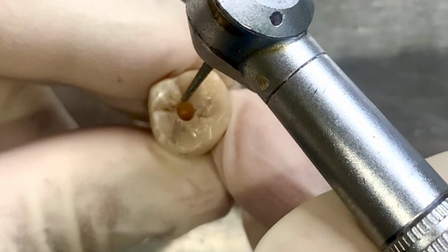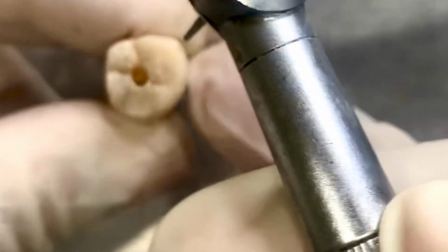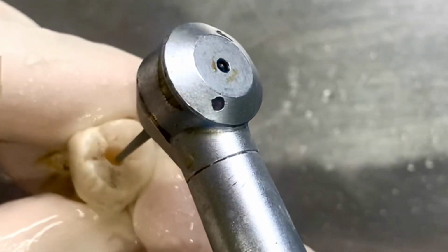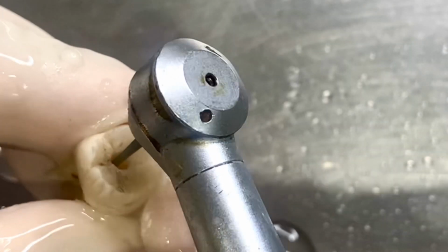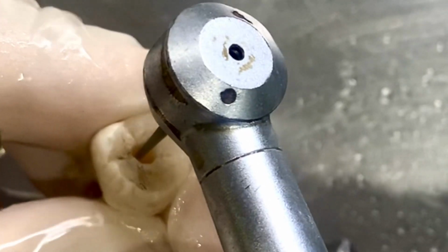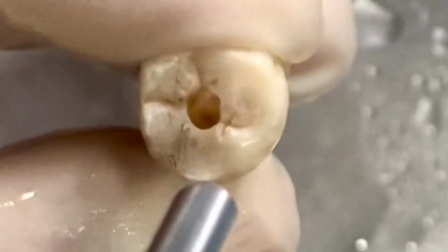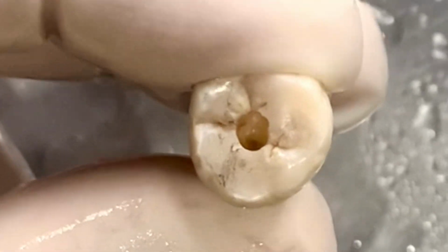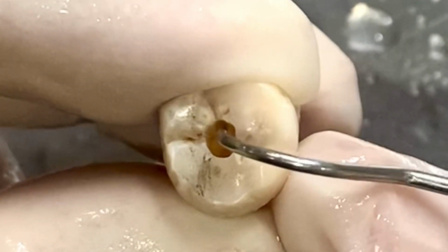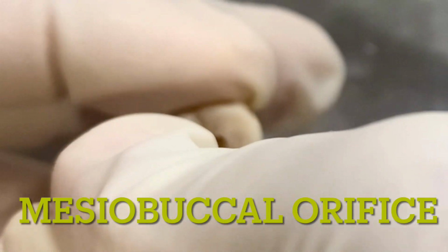Now using a tapered fissure burr, I will move forwards and then sideways to explore the other 2 canals. We can see all the three orifices. Now let us explore the mesiobuccal orifice.